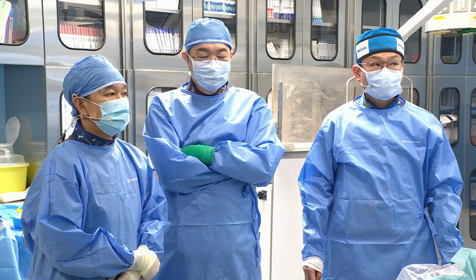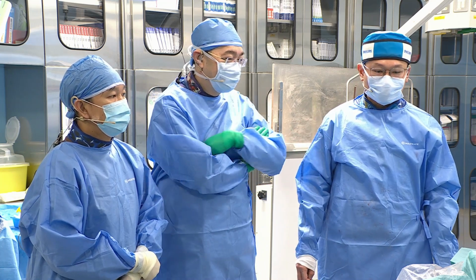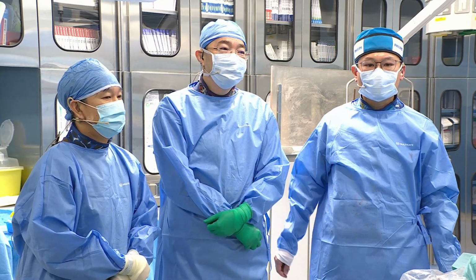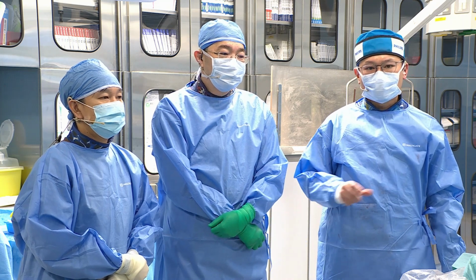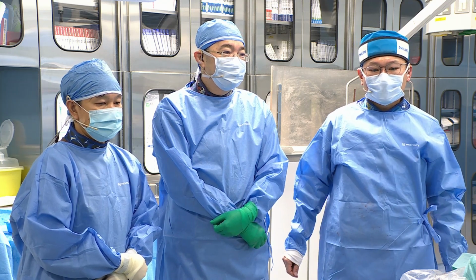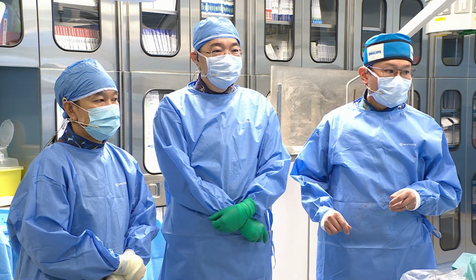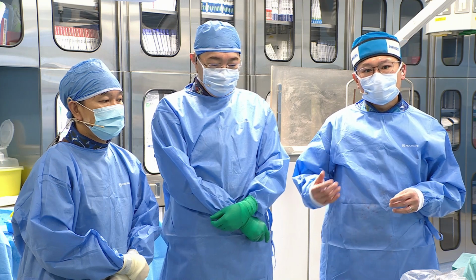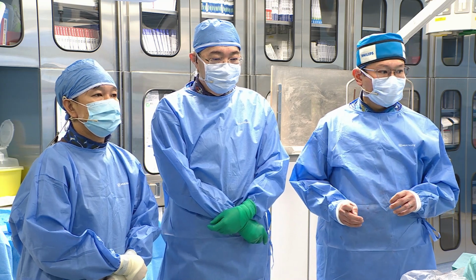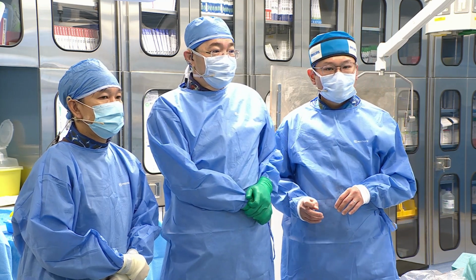Maybe just Aaron or Chee, do you have any last words before we close? No, I think we are pleased with how the case went. It was good that we were able to just do a provisional left main to LAD rather than a complex two-stent strategy. And I think part of that was the confidence that the imaging gave us. So I think it cannot be stressed enough that imaging improves outcomes, especially in complex cases like left main, like calcification. I'm glad we managed to get as good or as decent a result as we could have hoped for.